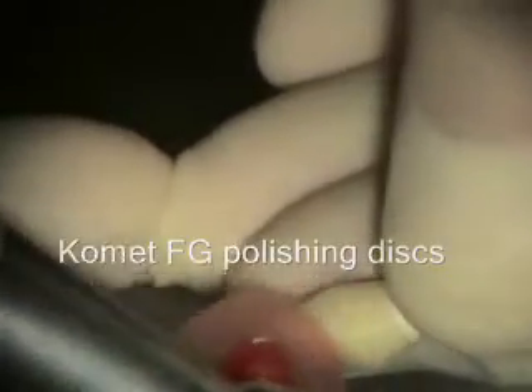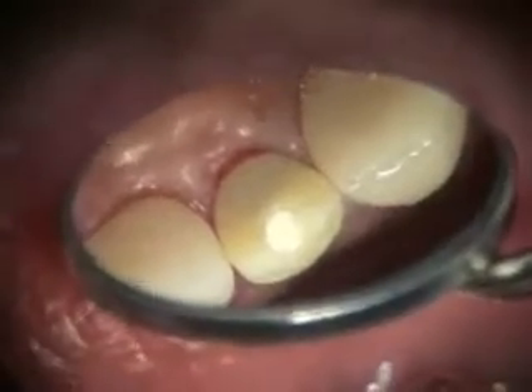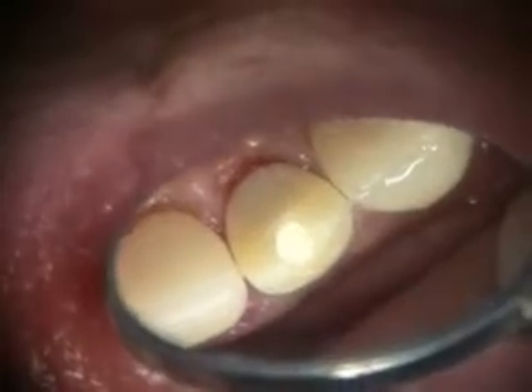Sometimes if it's too fat — sometimes teeth are skinnier at the root and you may need to taper a little bit more to get it to fit in there. It should fit pretty passively down. We've got our cotton in the access. I try to put as much cotton as possible so that the restorative dentist doesn't really need to remove a lot of composite to get to the screw hole and access that.